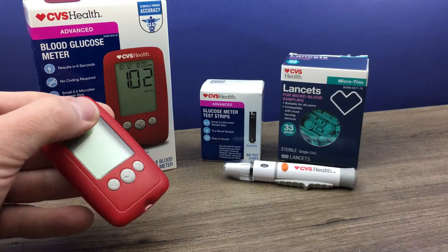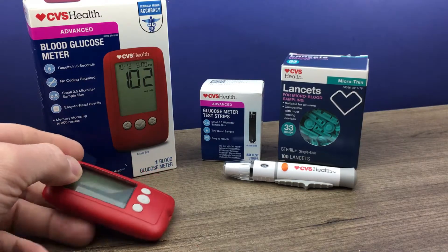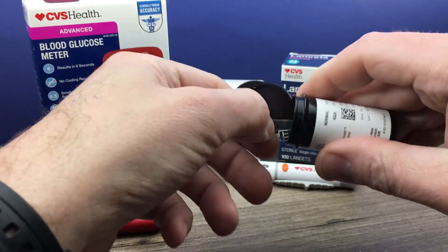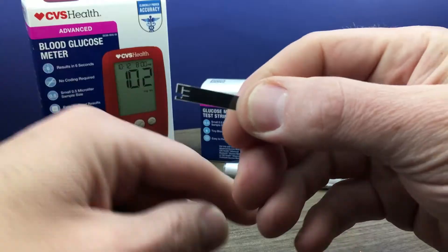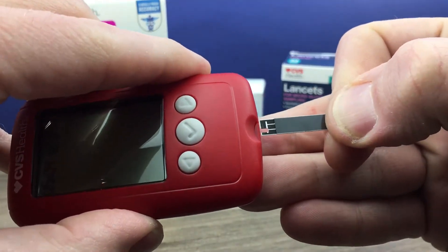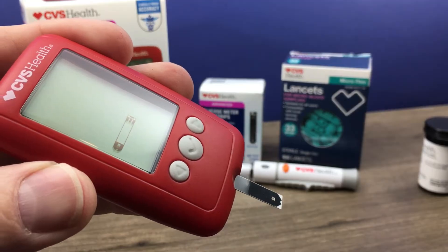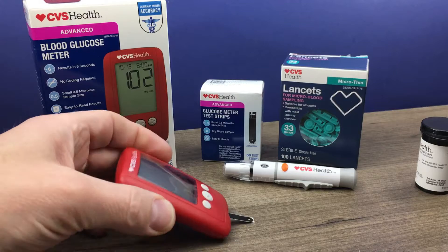First of all, you just need to load a test strip into the glucose meter. Always keep your test strip bottle closed when not in use. Retrieve a test strip and then close that lid tightly. That little end is the end that goes in the meter, so you just put that right in there. That will power on the meter, and the flashing drop of blood indicates it is ready for you to apply blood to the end of the test strip.